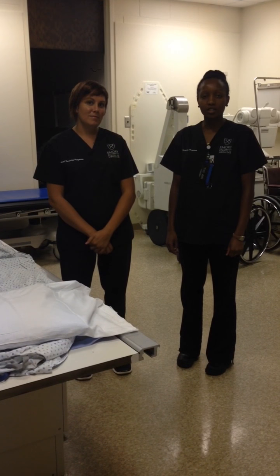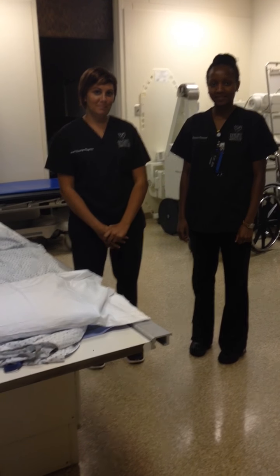I'm Abigail. I'm going to be the technologist. And I am Amanda, and I'm going to be the patient.